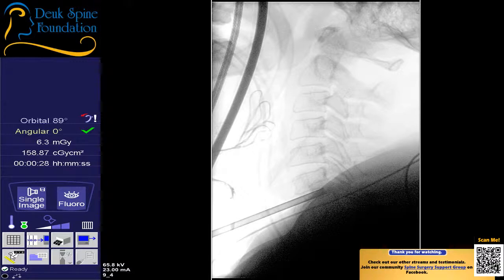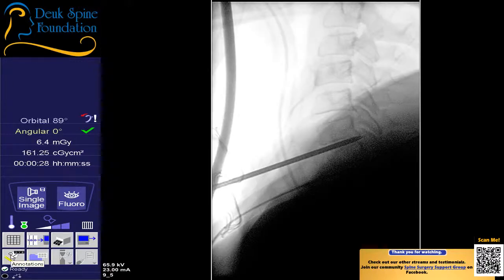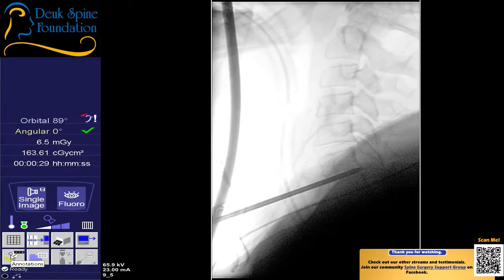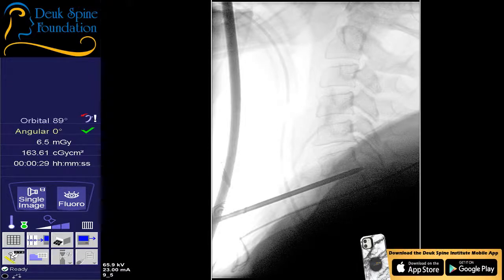Let's get ready to pull on the shoulders. And whenever you're ready, get an x-ray shot. All right, beautiful. Move the fluoro a little bit north so I can see 2. Shot. That's perfect. So 2, 3, 4, 5, 6, 7. We did 6, 7. You agree? Next is 5, 6. Everyone agrees, the one above. So I'm going to head up there next.